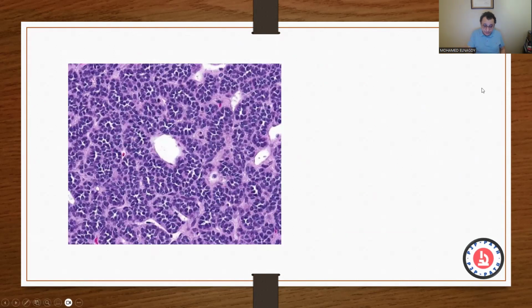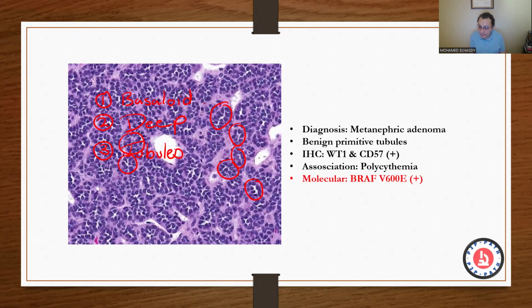From the previous lecture or from the previous session, can anybody volunteer? Metanephric. Yes. So what do you see here? Just the blue. Yeah, so forming basaloid, which is blue. Is it deep blue or just like light blue? No, it's deep blue, but it's not triphasic. Yeah, so it's deep blue and it's not triphasic. It's just forming somewhat, I guess, tubules. Yeah, like some tubules or tubule-like structures. So it's just monophasic forming tubules. So this qualifies it as a metanephric adenoma.